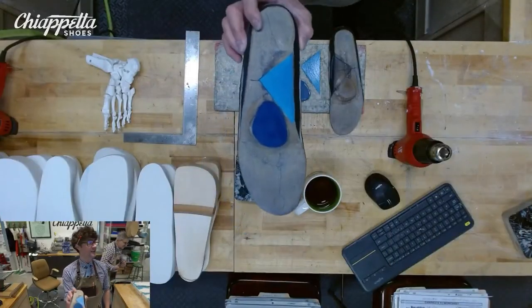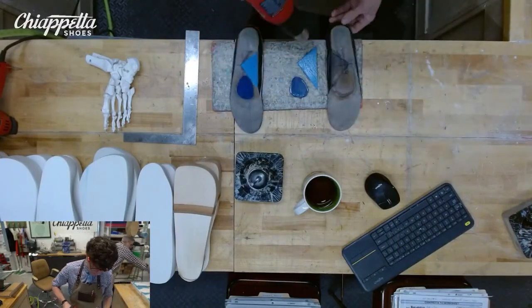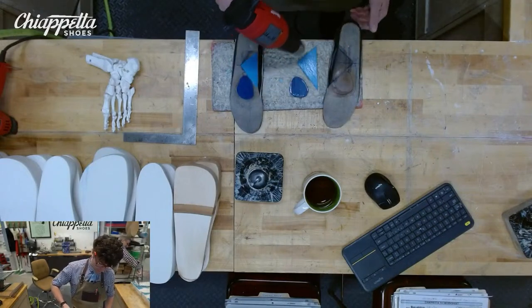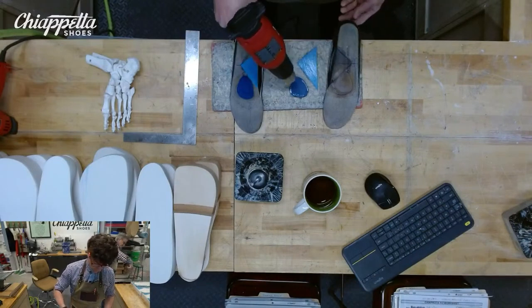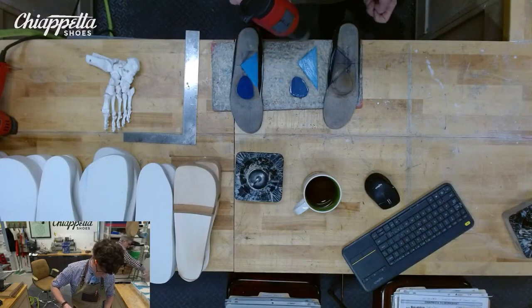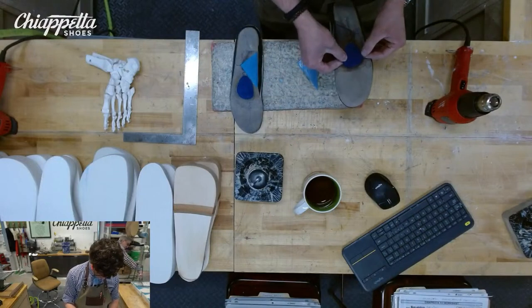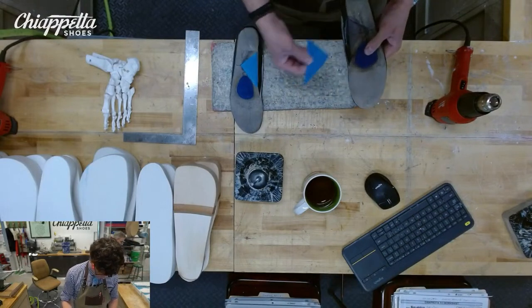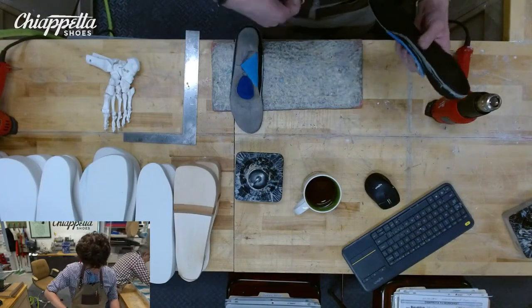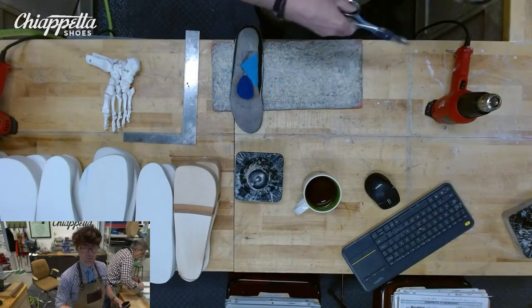All right, first set done right there. Nice dialed in, a little bit thicker met pad. That's a 45 durometer EVA. A little bit more dialed in compared to what we had on there before. A little bit thicker, a little bit firmer. And we're adding this scaphoid pad in here too. So I think this is going to be a winning solution. We'll see what we can do with this combo here. And she's going to come in for 2 new sets. So I think we'll be in good shape once she comes in for those new ones. I'm going to take this to the grinder and get you guys rolling on your day.